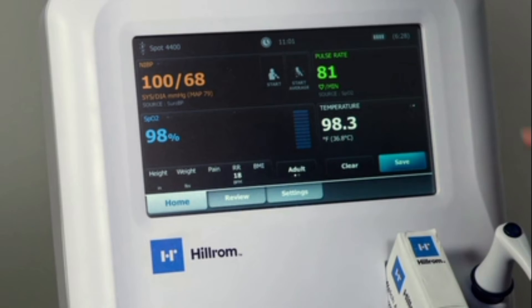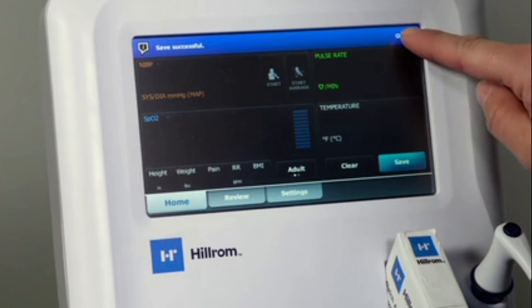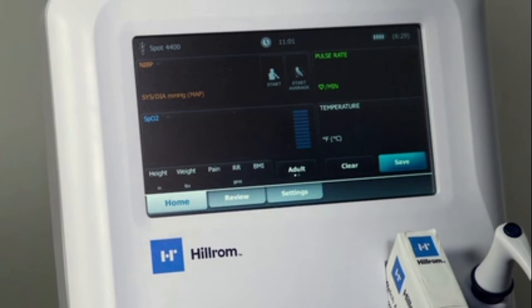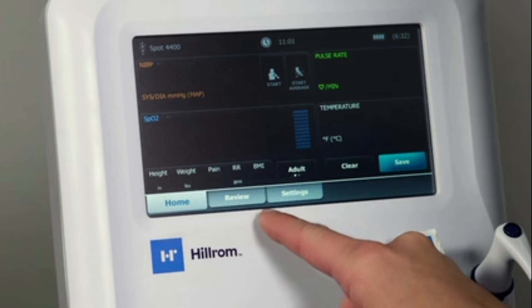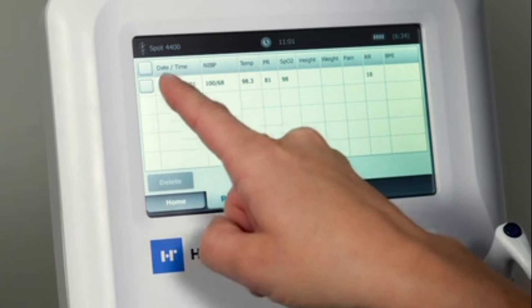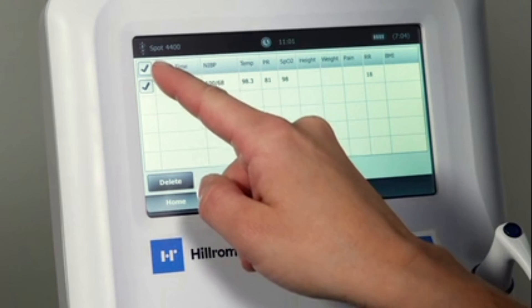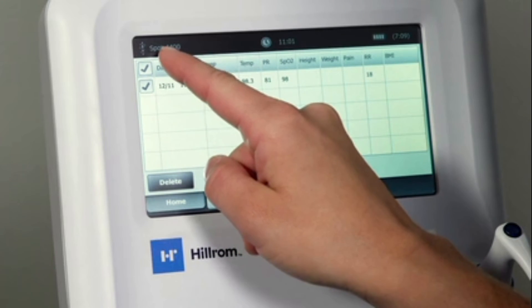To save data to the patient review tab, press the save button. Once saved successfully, a message will appear at the top of the screen and all patient data will be cleared from the home screen. Any saved data is available for review via the review tab at the bottom of the screen. Please note that this data overwrites after 50 saved readings or 24 hours, whichever comes first. You can delete one reading at a time from the review table by checking the selection box and delete, or you can select and delete all readings by pressing the top selection box and delete.